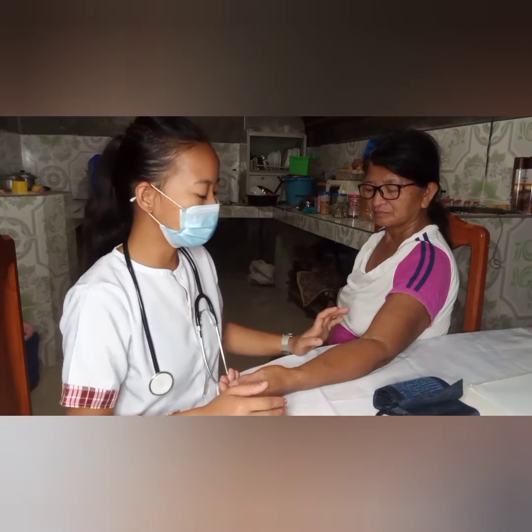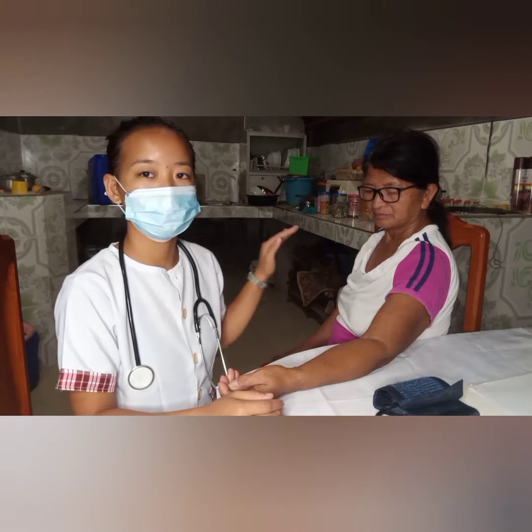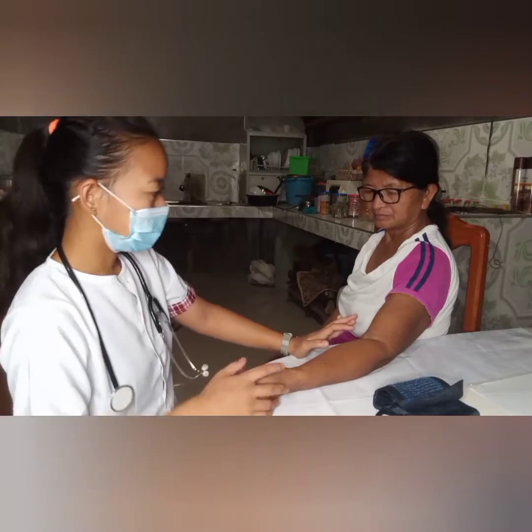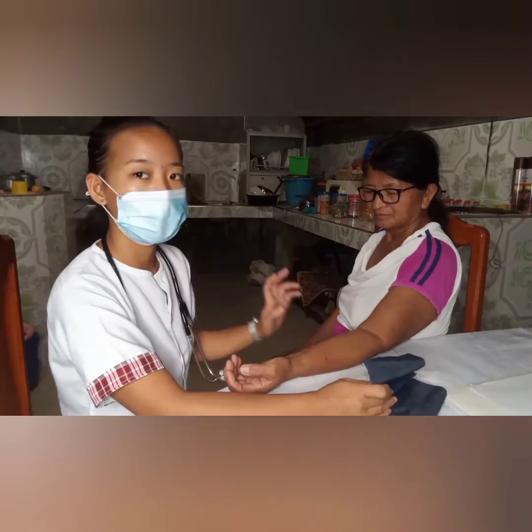On getting the blood pressure of the patient, we have to note that the arm is on the level of the heart of the patient. And we can use either the right or the left arm.